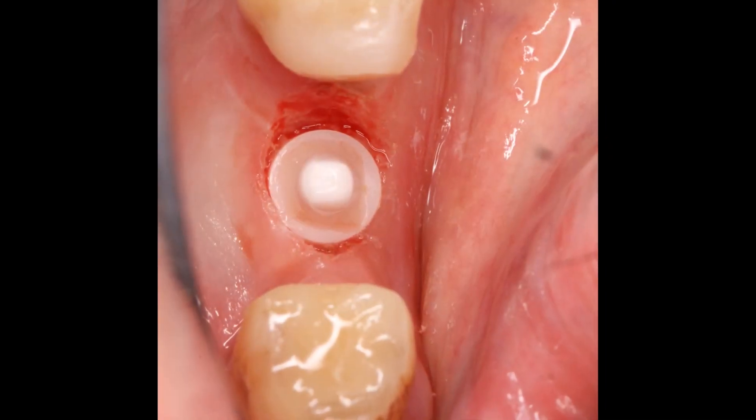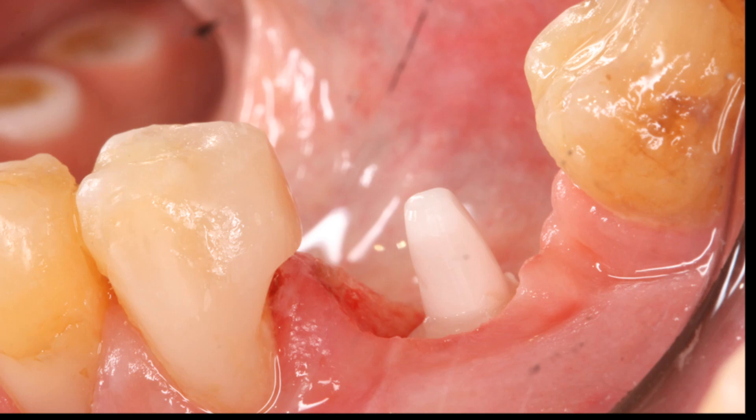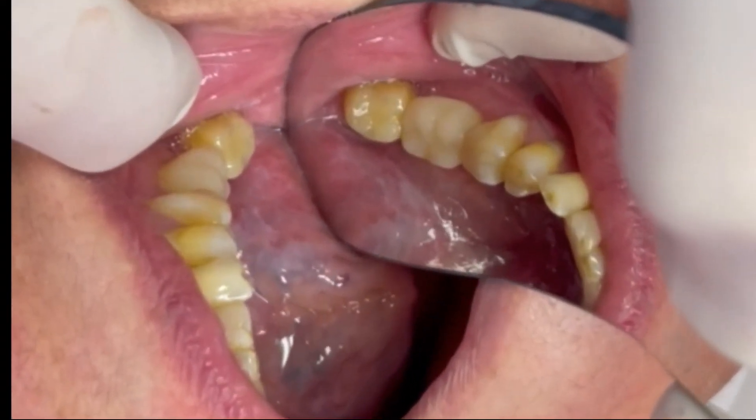This type of implant has a cementable abutment. From this point onwards we will be treating this post as a tooth and we will be making a crown same day with our CEREC digital technology.